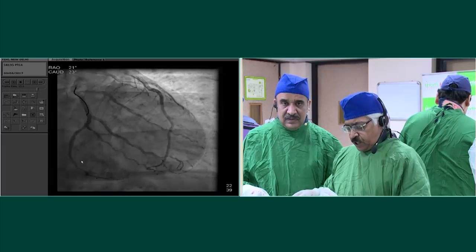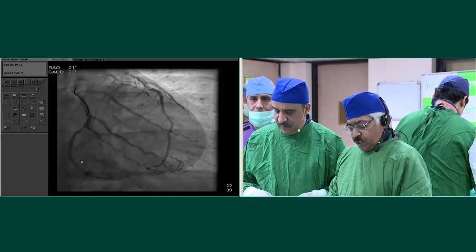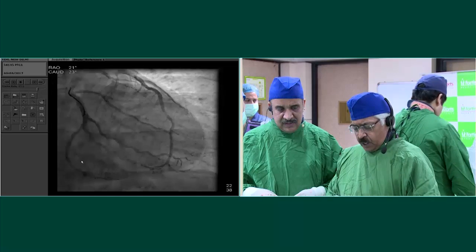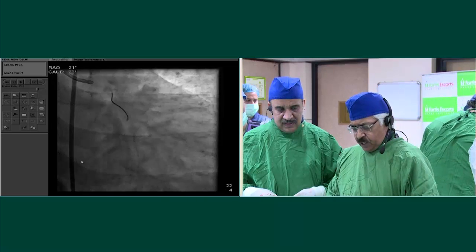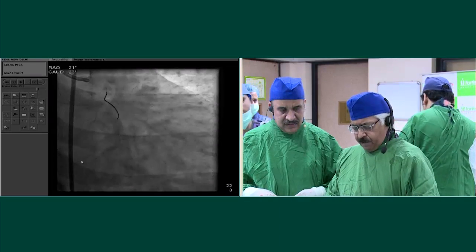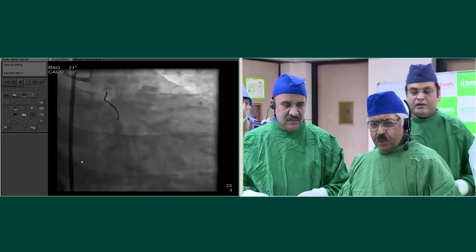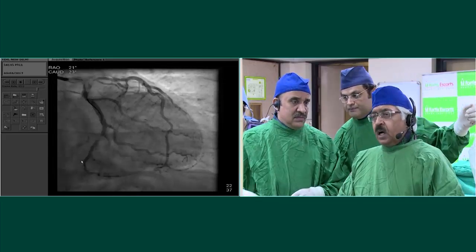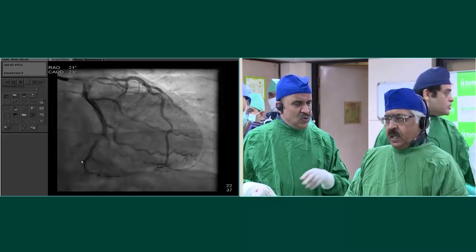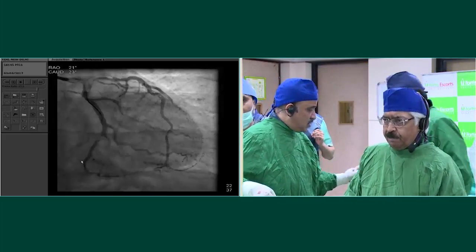So, with everybody's consent, I think this young guy with a circumflex, 42 years old, high-grade stenosis, 10 millimeter gradient, irrespective of the FFR, I believe that he could be at a higher risk of events. These are soft plaques. So I'd rather put a bioabsorbable scaffold into at least the circumflex as well as the LAD. I'll have to be very careful about the LAD, about coming into the left main.